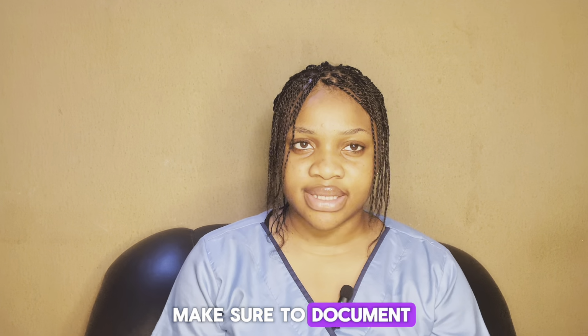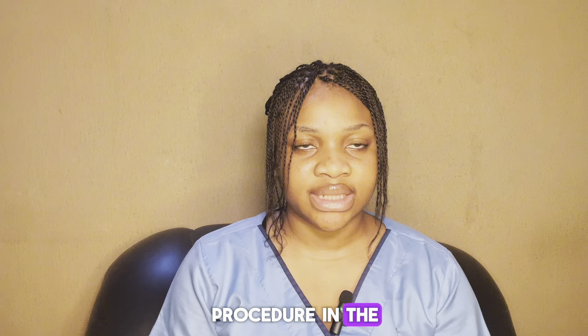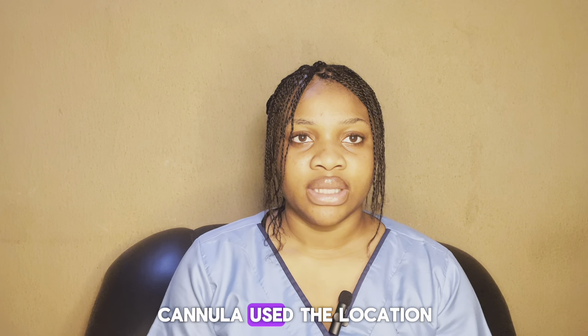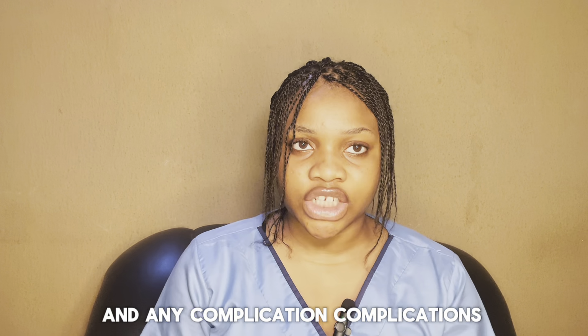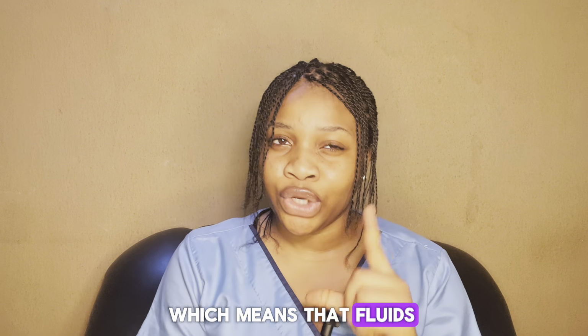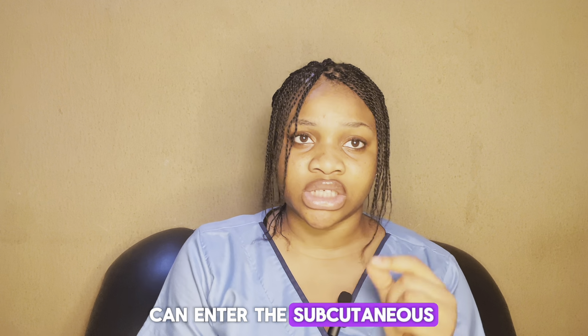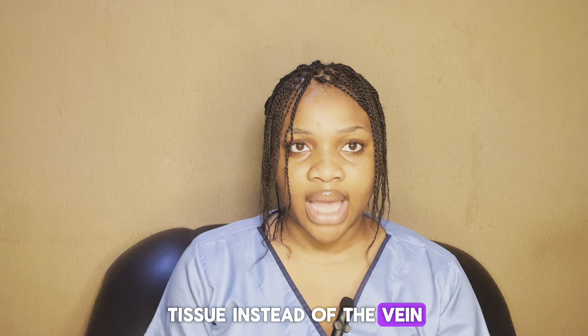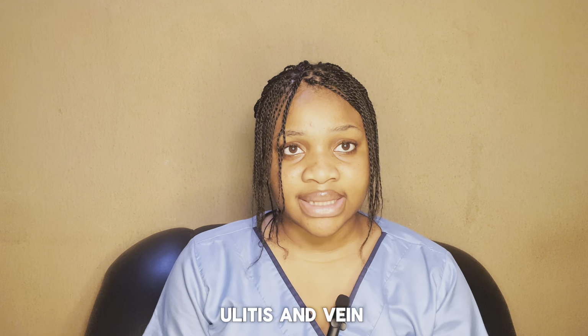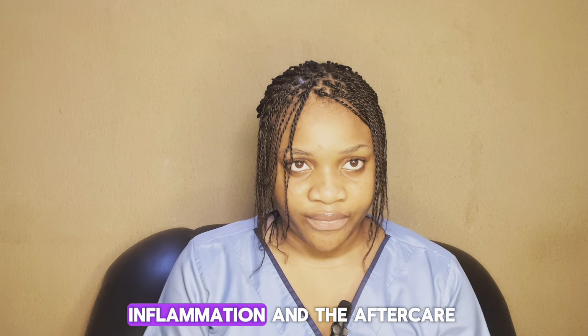Ensure to document the procedure in the patient's file. Note the time, the date, the type of cannula used, the location, and any complication. Complications are: cannula can tissue, which means that fluid can enter the subcutaneous tissue instead of the vein. Hematoma formation. There can be cellulitis and vein inflammation.